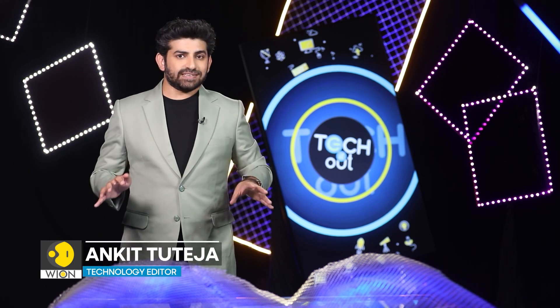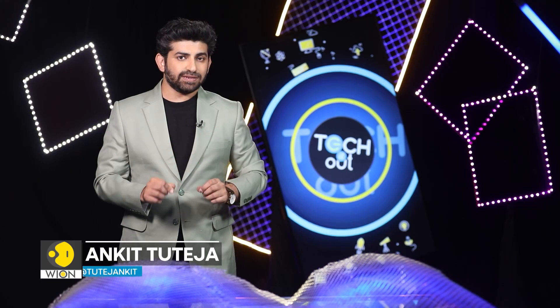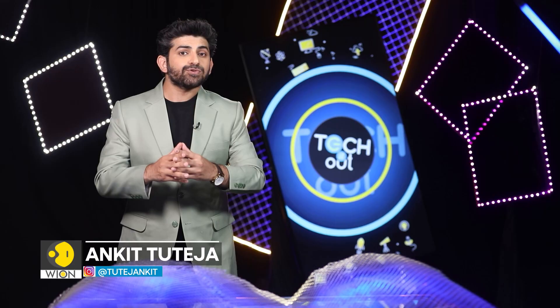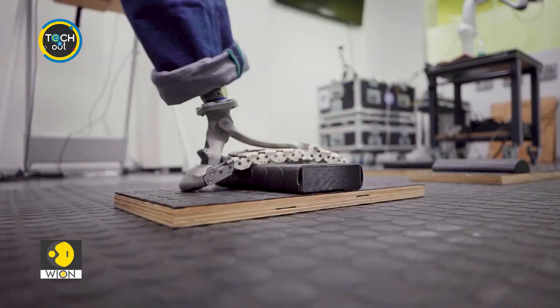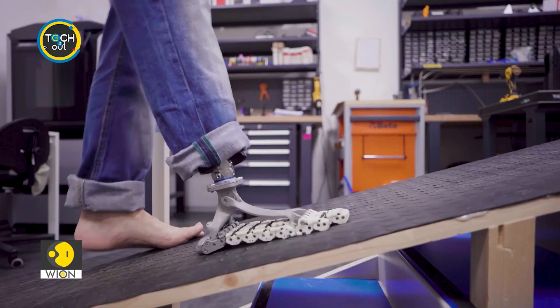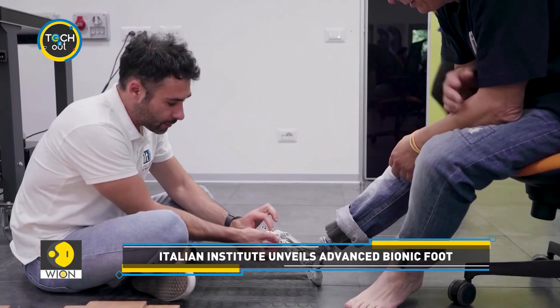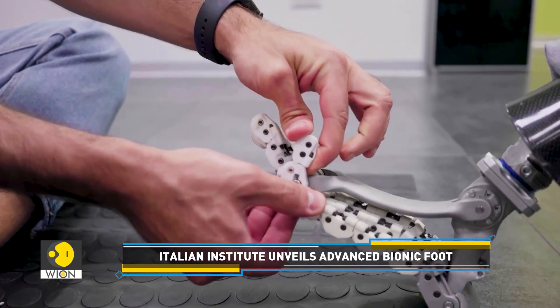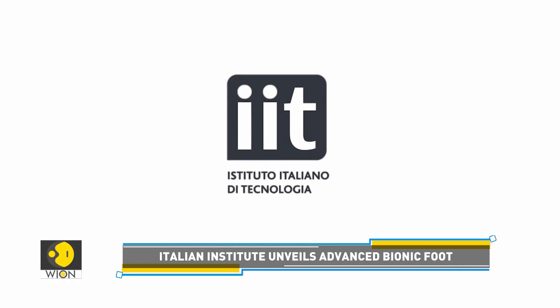Technology never ceases to amaze us. It can now even remove physical barriers faced by disabled people. In this story, we show you a breakthrough development in the field of prosthetics. A prototype of a prosthetic foot that replicates the anatomical structure of a real human foot has been unveiled by the Italian Institute of Technology.